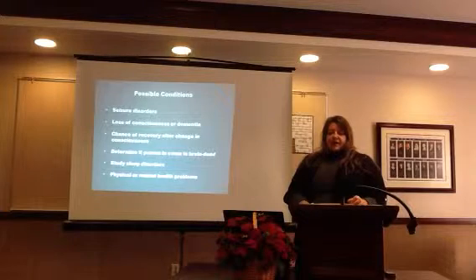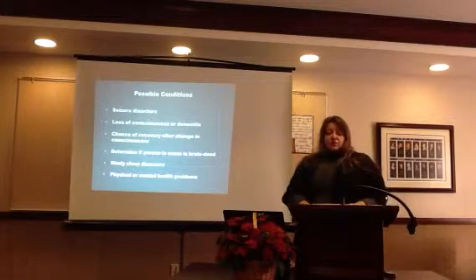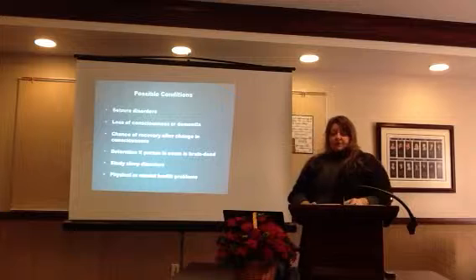They also help to diagnose sleep disorders such as narcolepsy, as well as physical problems with the brain, the spinal cord, or the nervous system, and mental disorders.